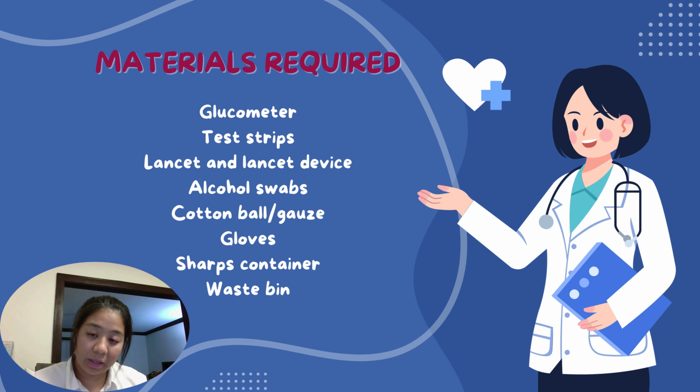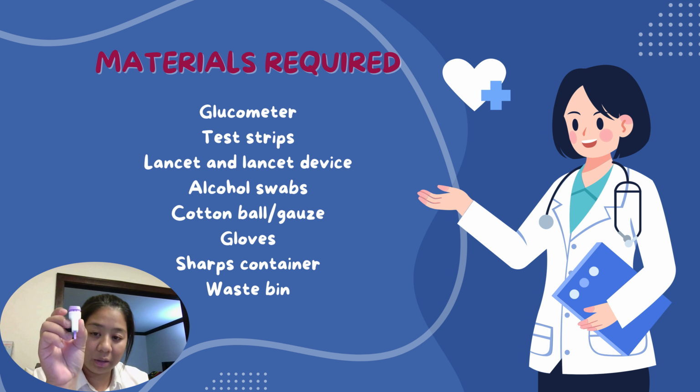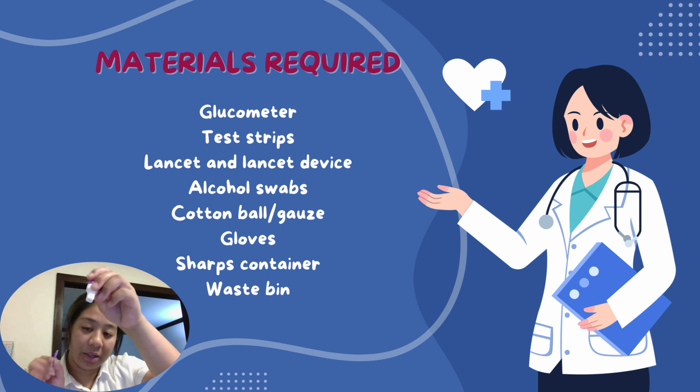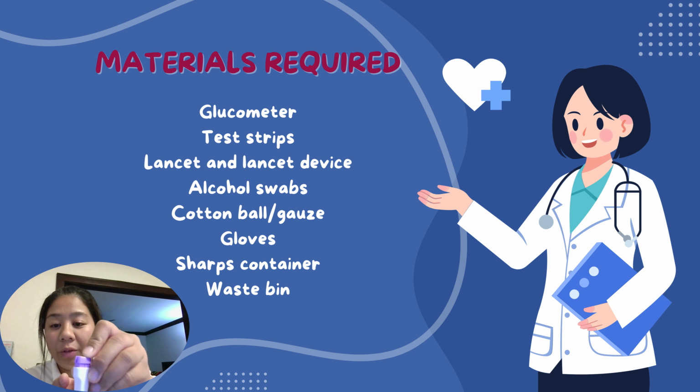However, since that is not very common now, we have a newer lancet system that is one time use for each patient. We remove this and then we use this to break the fingertip.